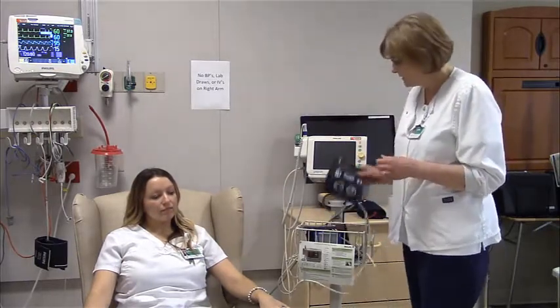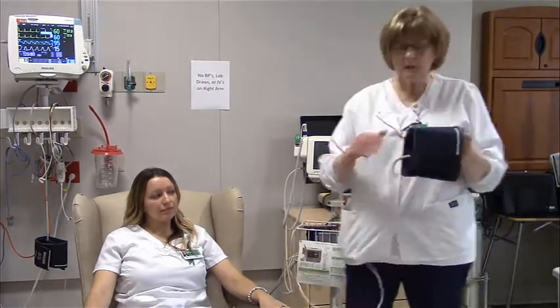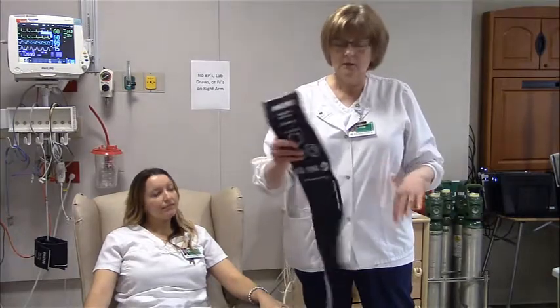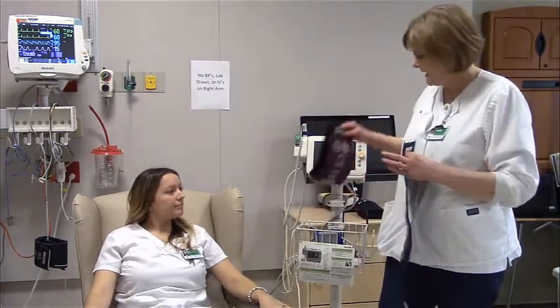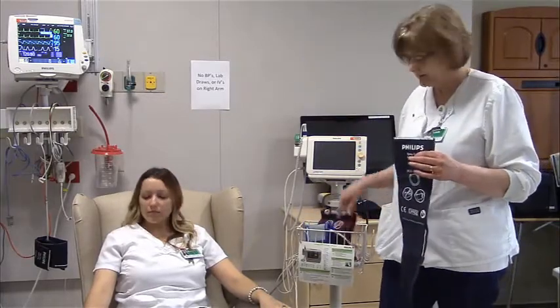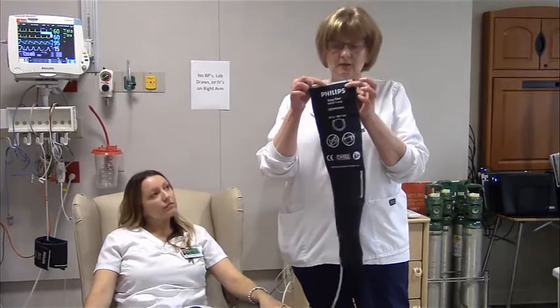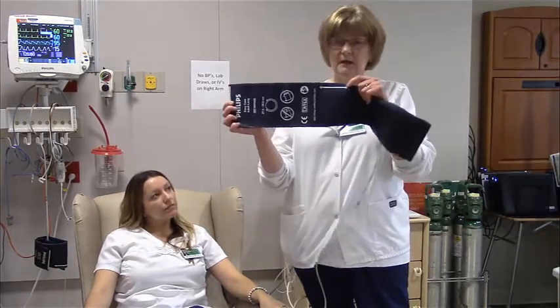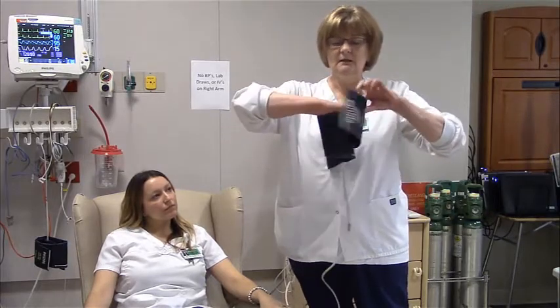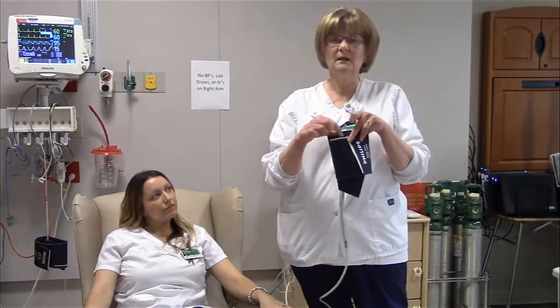Next thing I want to talk to you about are blood pressures because you will be doing them. Let's first talk about sizing up a blood pressure cuff. You do have different sizes available, so you have to know how to size that cuff for your patient. There is always some type of indicator line on one side, and you'll see an arrow on the other. So when you're putting this on your patient, this indicator line needs to fall somewhere within the index line.